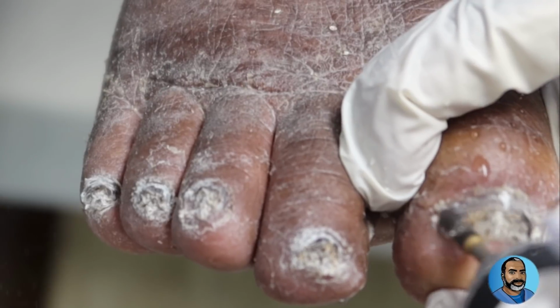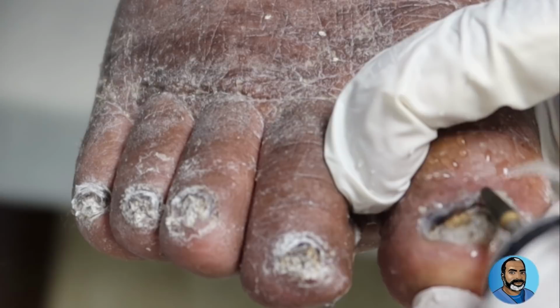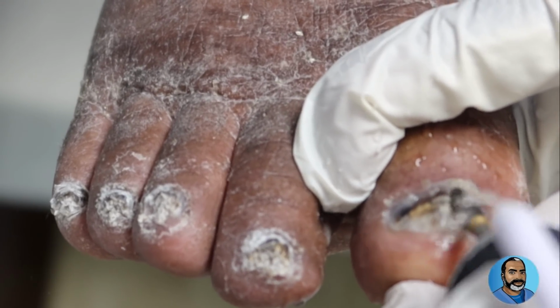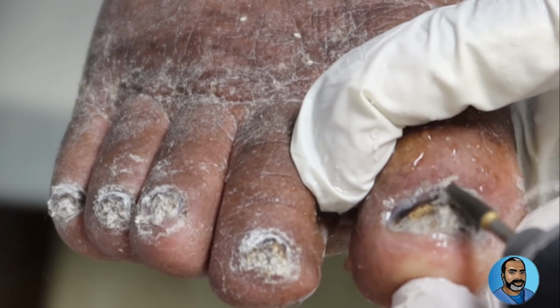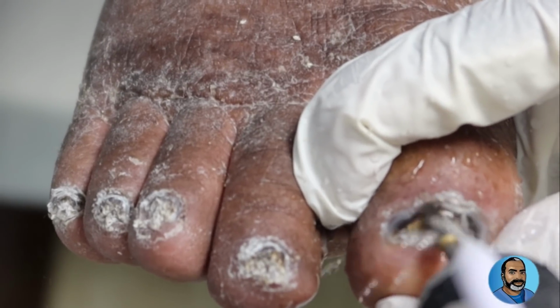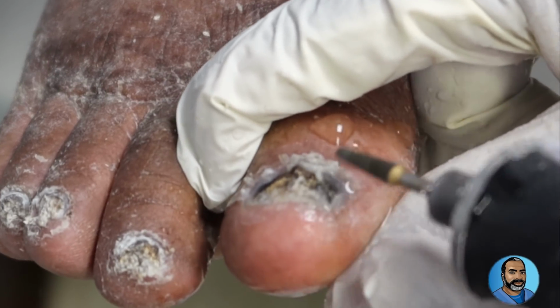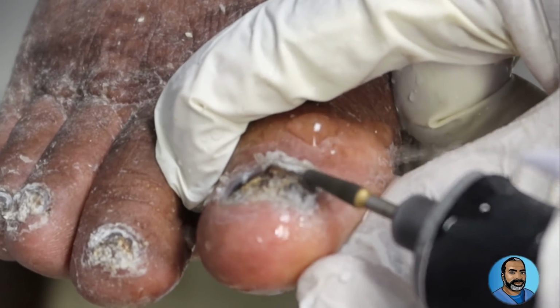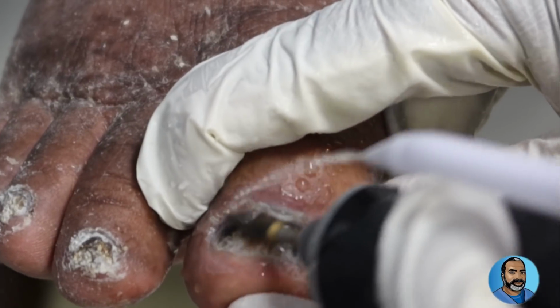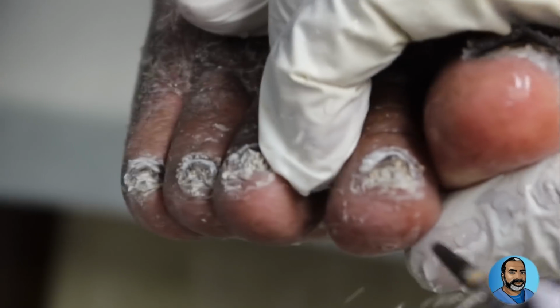Let me know if this gets too irritating. Yeah, I'll definitely keep you posted. You must have real good vision. Oh, yeah. Is that water or does that have iodine in it too? No, just water. Okay. Water is the best medicine on earth. You get a small clipper to deal with your cuticles.